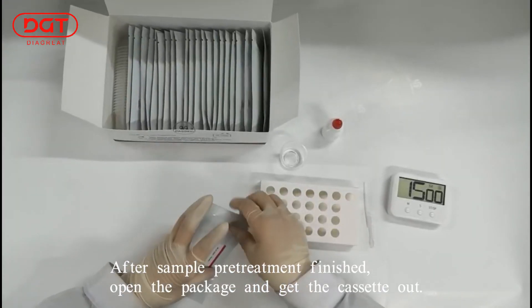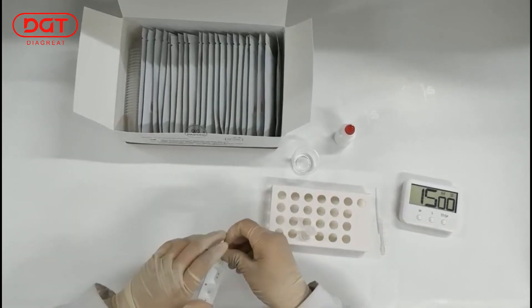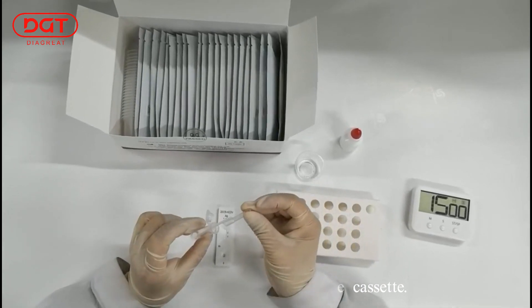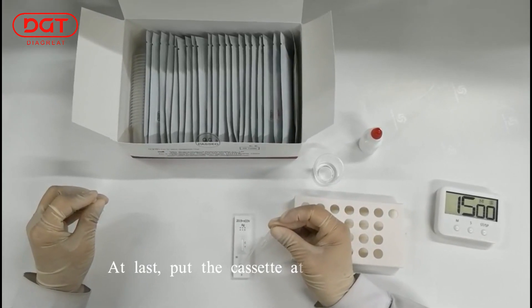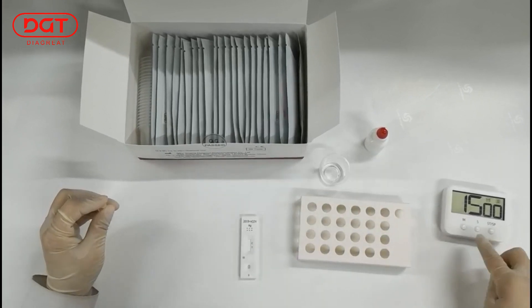After sample pre-treatment is finished, open the package and take the cassette out. Use the pipette to suck 100 µL of mixed sample and add to the cassette. Put the cassette at room temperature and read the result at 15 minutes.